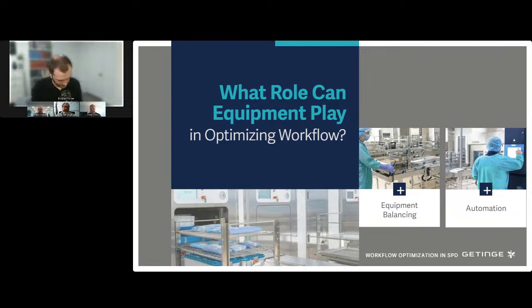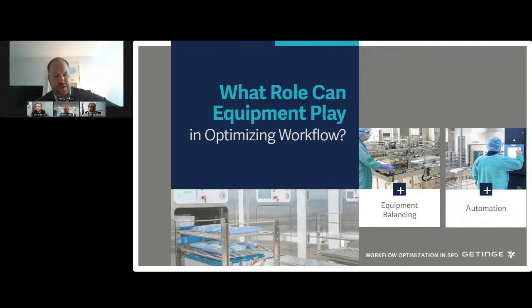Well, it plays a significant role, Bobby, and I'll give you a great example of something that I've seen out in the field. We were asked to come out to do an evaluation at a facility, and they couldn't figure out why they were bottlenecking so much in decontam. Aside from the layout where their cart washer was across the entire workflow, you had, I think it was 6 washers in place, but they only had 1 sink. And so not only were you bottlenecking case carts right in the middle of your workspace, but you're trying to feed 6 washers with 1 sink. And so the equation didn't add up. And so you naturally had that bottlenecking.